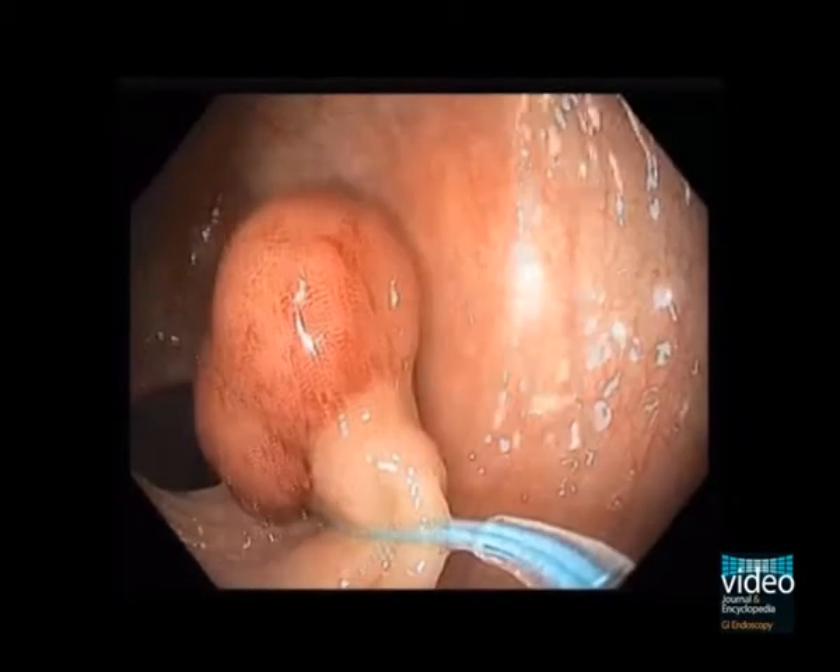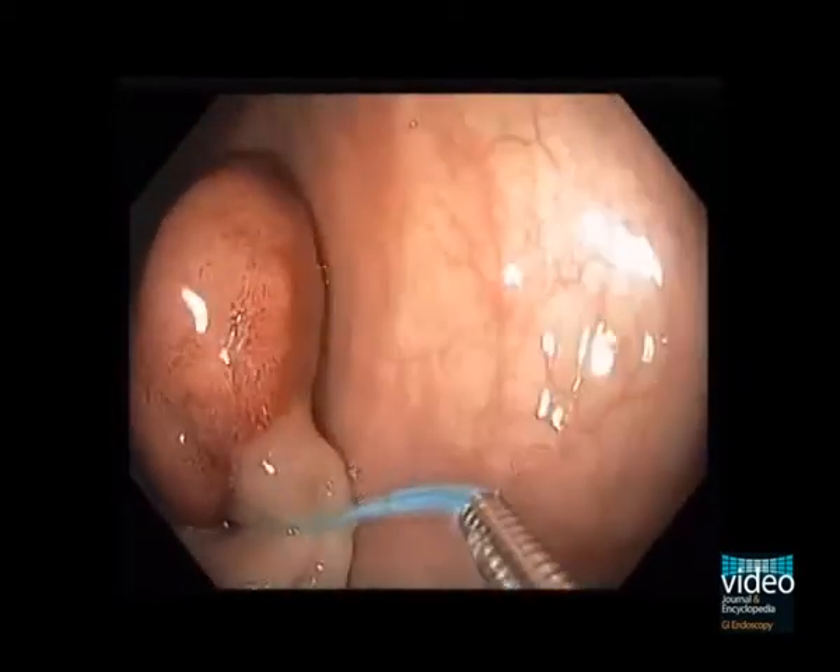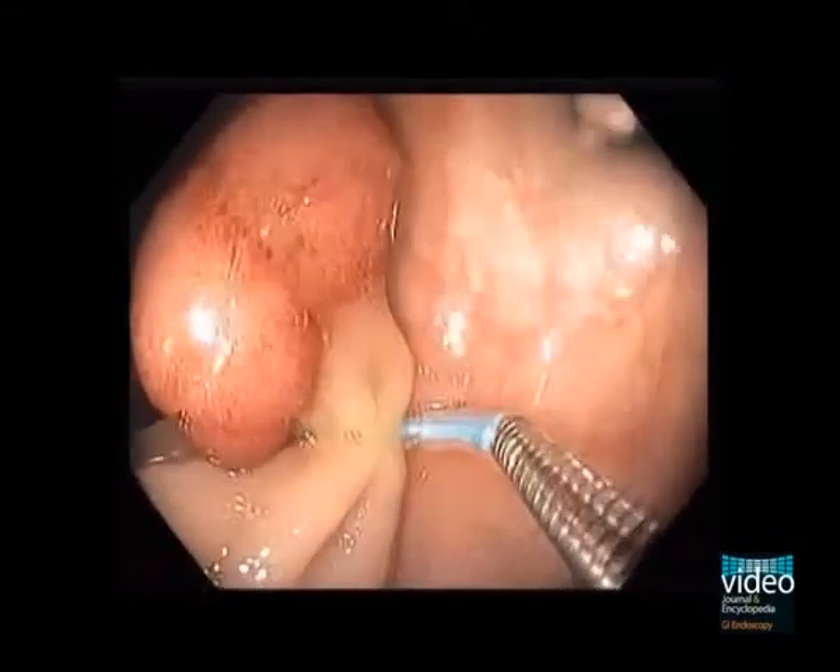After the Enderloop is in a good position, it is tightened and then released. The tightened Enderloop tamponates the vessel in the pedicle.